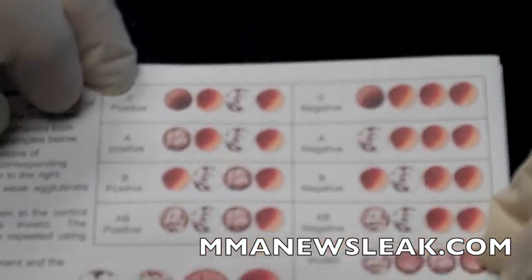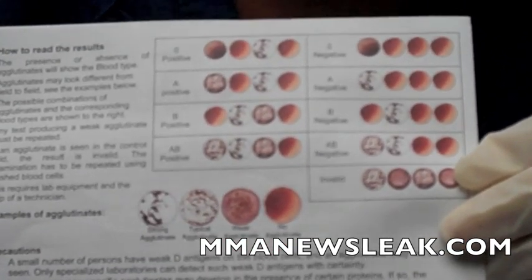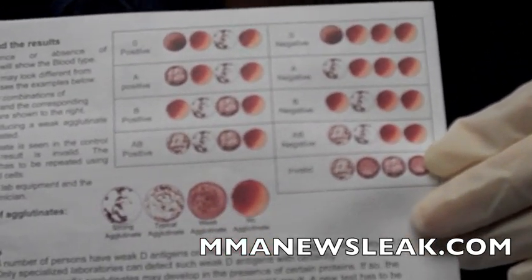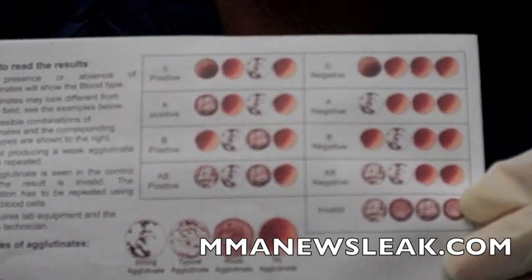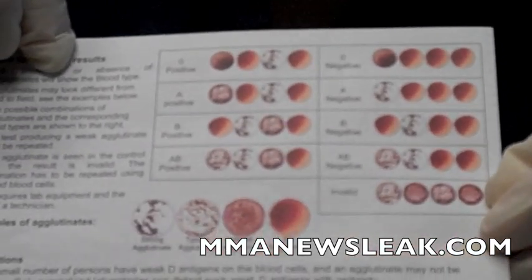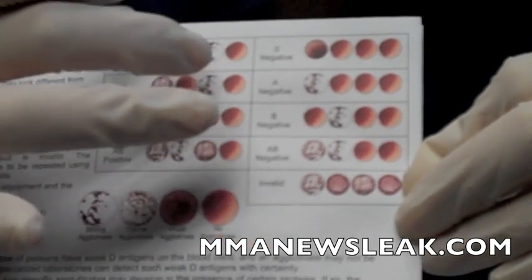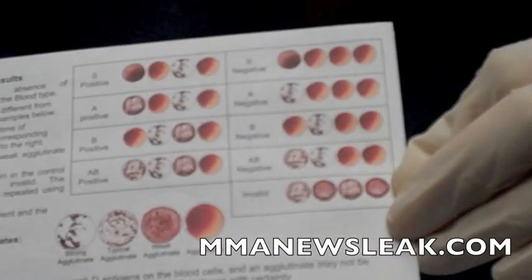We call the binding of the proteins agglutination. For O positive, you can see how the anti-A and anti-B circles are smooth because it doesn't have any of those proteins, but the third circle identifies if they're positive or negative — they have the markers that will break up a positive. Versus O negative, where all of them are smooth because there are none of the proteins at all — not for anti-A, anti-B, or the anti-D. A positive clumps up on the anti-A and the anti-D, which is the third column. A negative just clumps up in the anti-A because the third column being smooth means that they're negative.